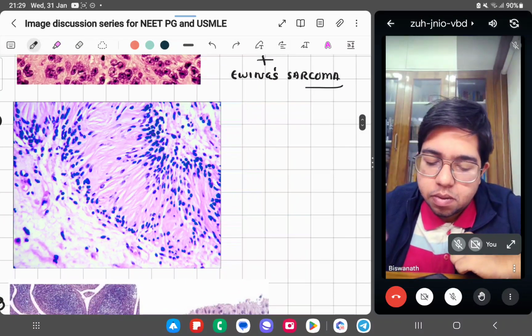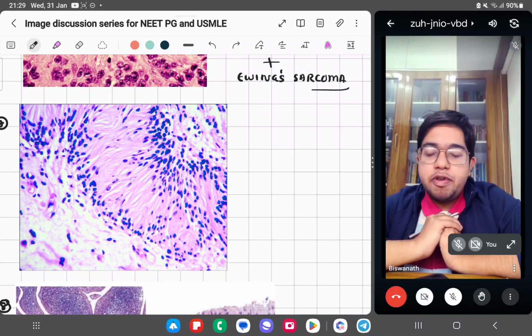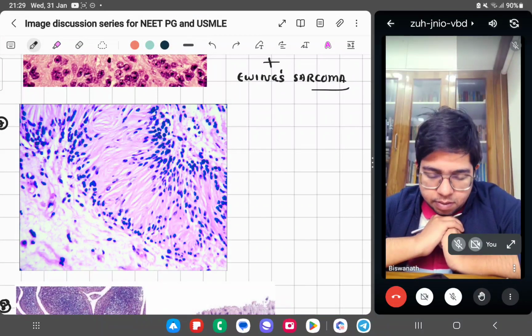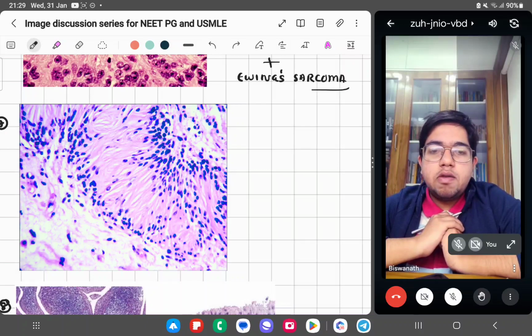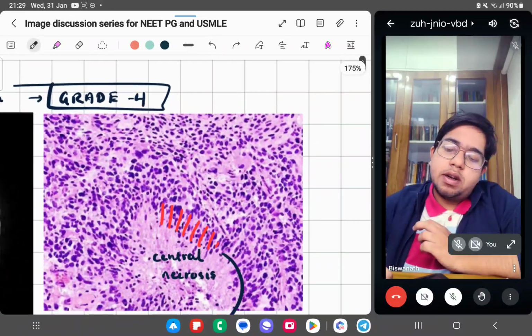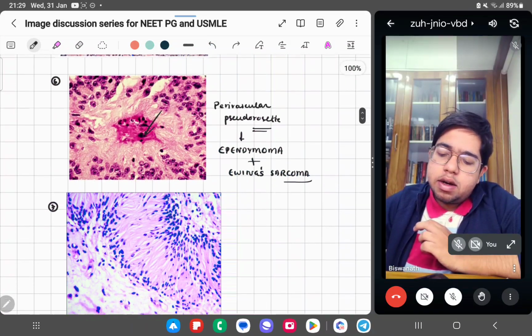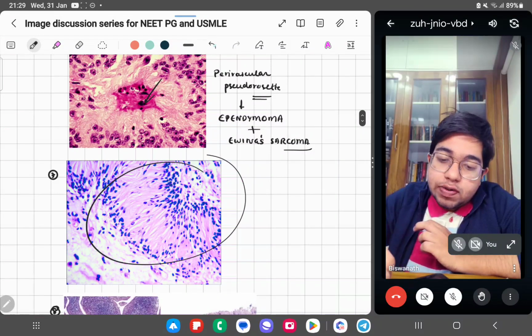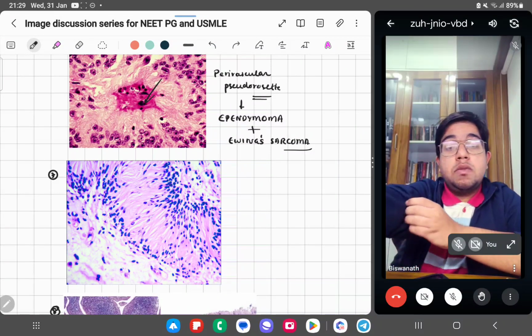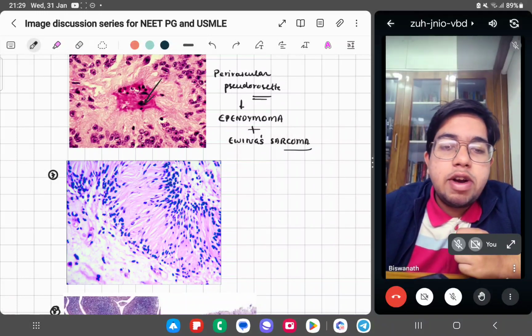This one. Can you tell me what this is? Can you relate and tell me what this is with this pattern? This one and this one look familiar, right? Familiar. Can you identify?